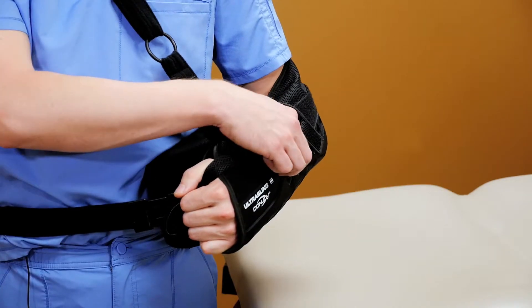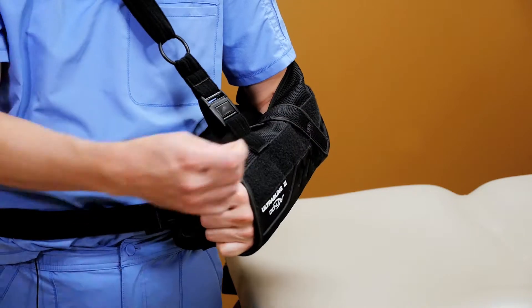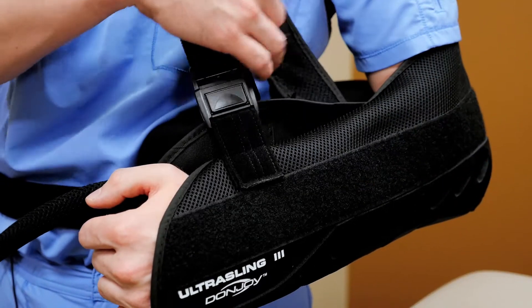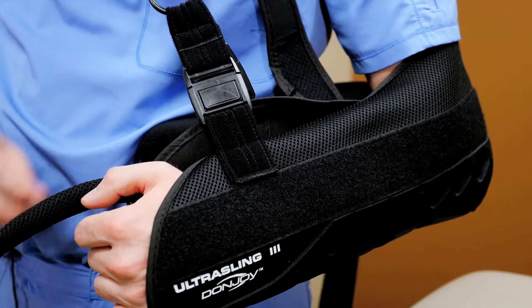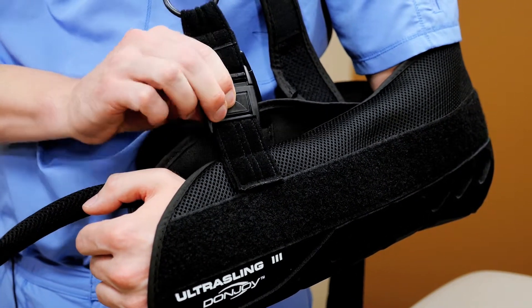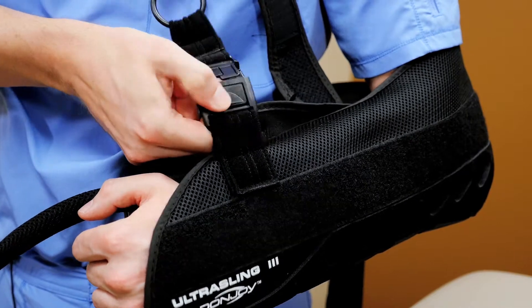The first step is just to remove the strap from the hand and the top of the immobilizer, then unbuckle the strap from your waist, and then the last step is just to undo the clips at the immobilizer. Make sure when you remove the immobilizer to keep your upper arm close to your torso.